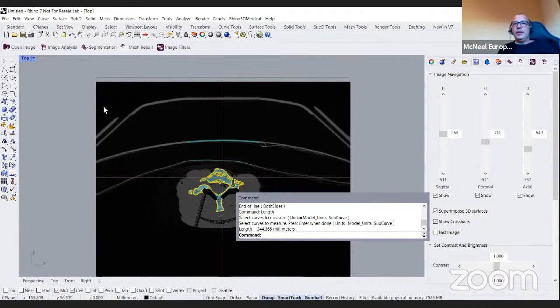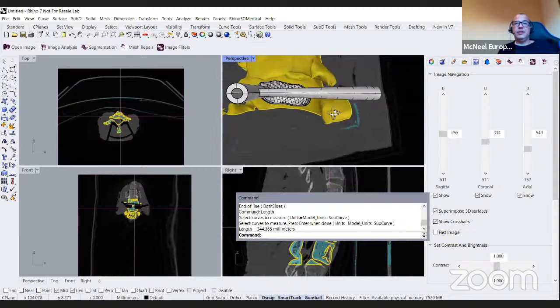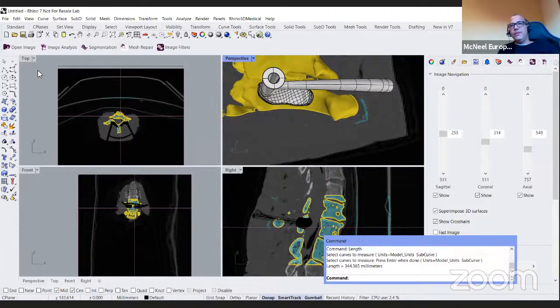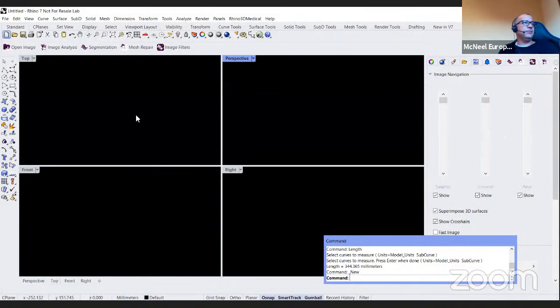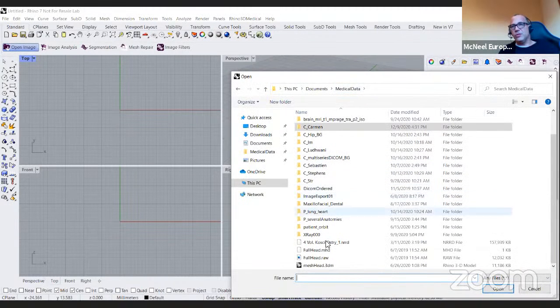Right. More questions by Eli Suarez this time. When the TAC is bad, are there tools to improve the mesh surface? When the TAC, I guess the CT images, are of bad quality, are there tools to improve the mesh surface? From a bad image, you create a not optimum mesh surface. So are there ways to improve the quality of the mesh surface?